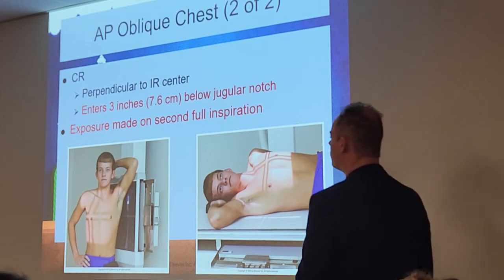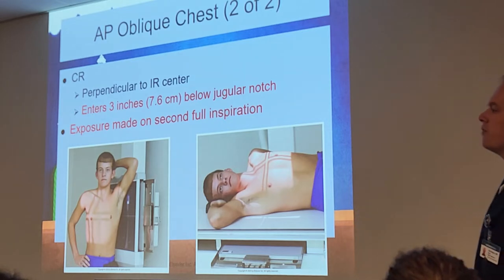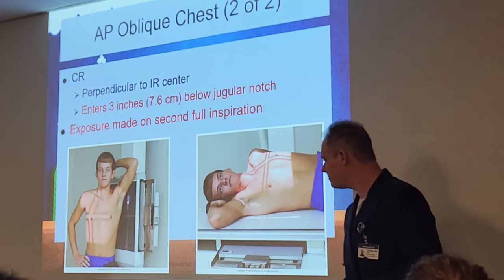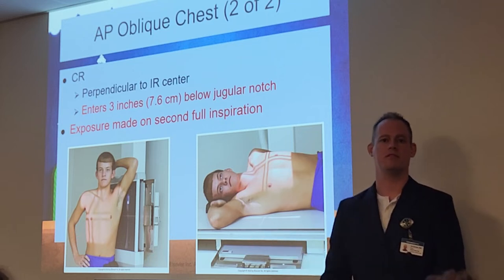And same as we've talked about with all our chest x-rays, guys, that exposure will always be made on the second full inspiration to make sure those lungs are fully inflated. Very, very important. So looking at this picture right here, what position is this guy in? What specific position?